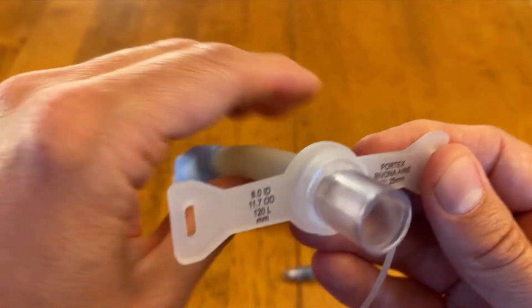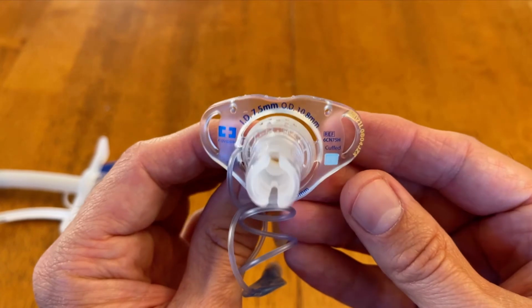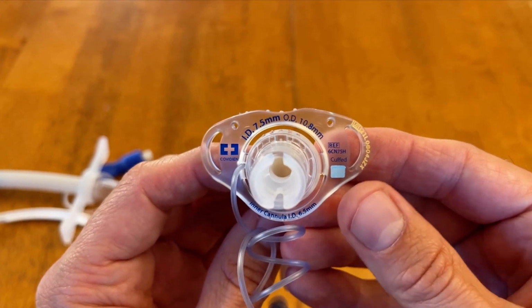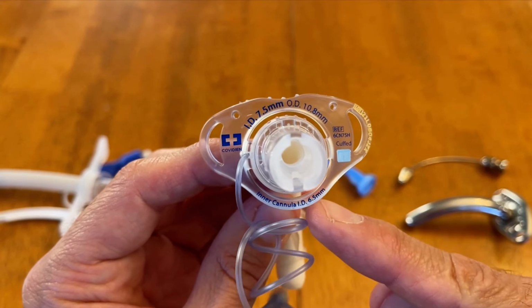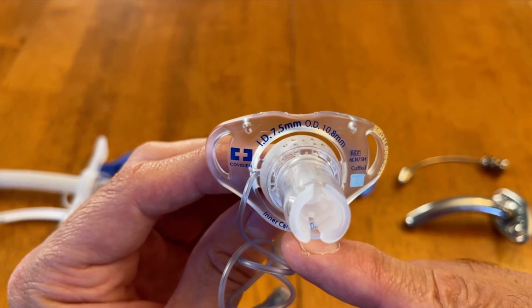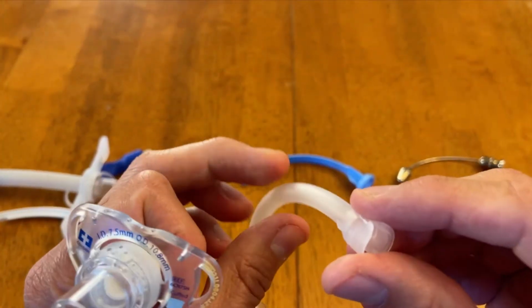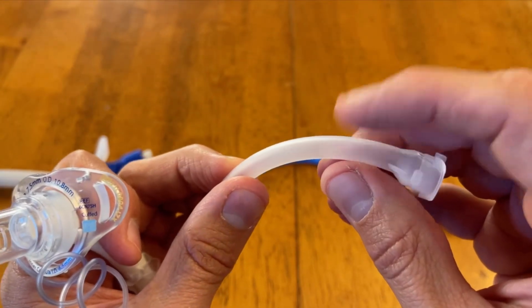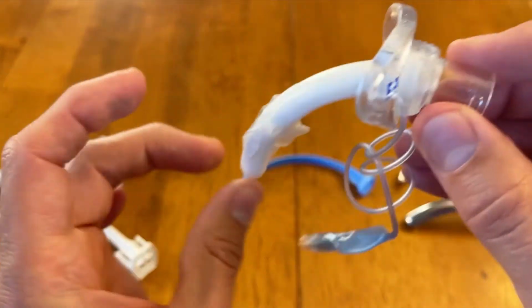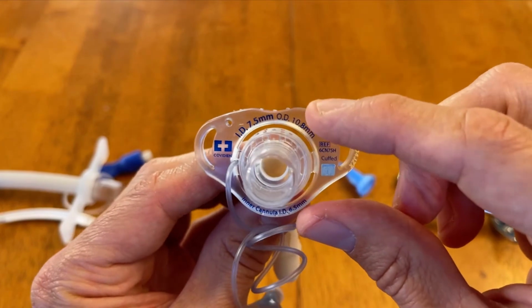So that was the Bivona, and the one in the middle here I'm going to reach for is my Shiley. And as I hold that up, I'll let you look at the flange. Like I said, there's information. Every manufacturer is a little bit different, but you can tell some information about internal diameter, outer diameter, that it's cuffed. I also want to point down to the bottom here where it also gives the internal diameter at 6.5 millimeters. And if you can't read that, it says inner cannula. Because as I mentioned before, this Shiley has an inner cannula, which I'm going to take out here. So what they're really talking about, that 6.5, is the inner diameter of this inner cannula here. That's important to differentiate from these readings of the internal diameter without. So this is just the external tracheostomy tube, and that's the internal diameter for it as well as the outer diameter for it.